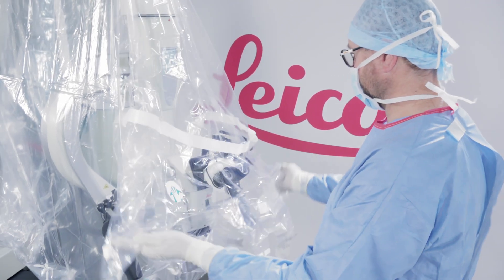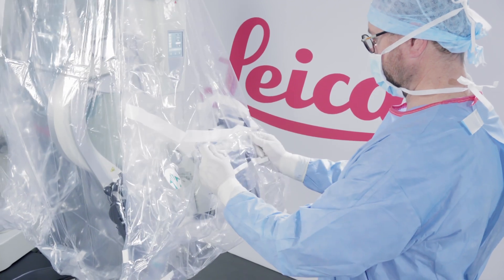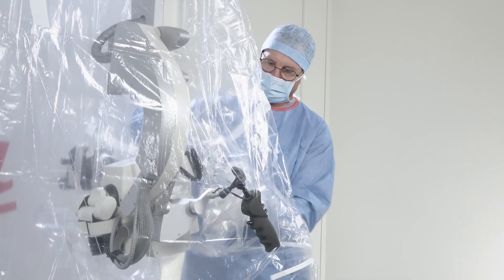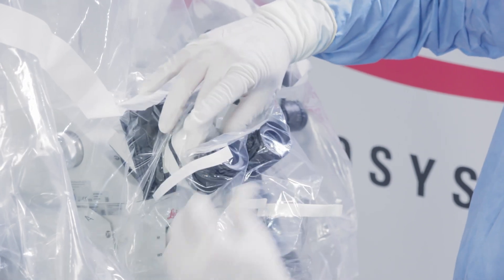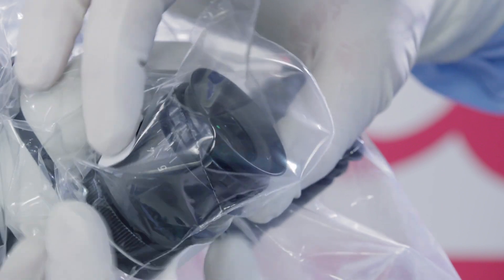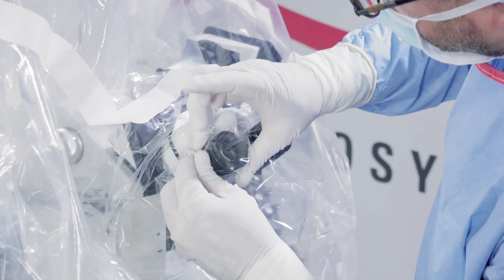It's now time to drape the binocular tubes. The drape has several binocular tube covers. Choose the middle one from the three facing you to cover the surgeon's eyepieces. Be careful — the eyepiece covers are perforated at their end. It is important to be gentle in order to avoid any detachment.